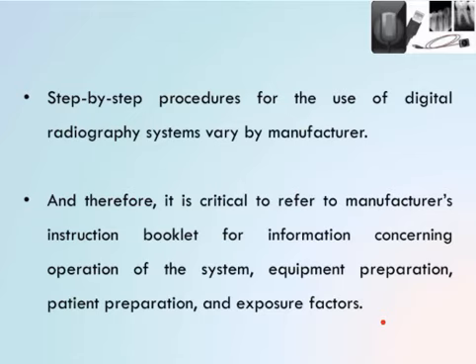The sensors differ in shape and thickness by manufacturer, and different manufacturers will have specific instructions on how to use the sensor or the sensor software.